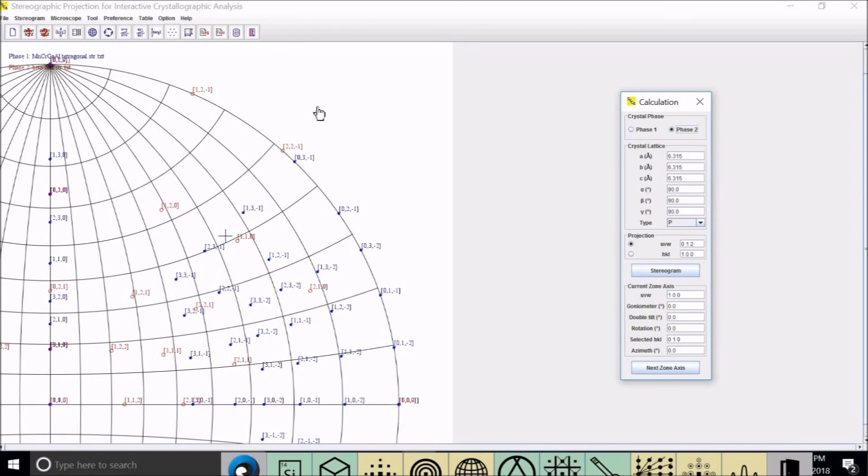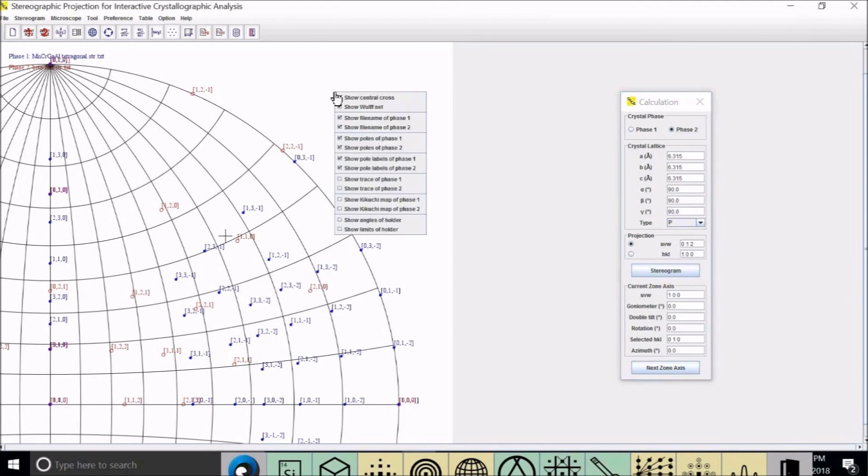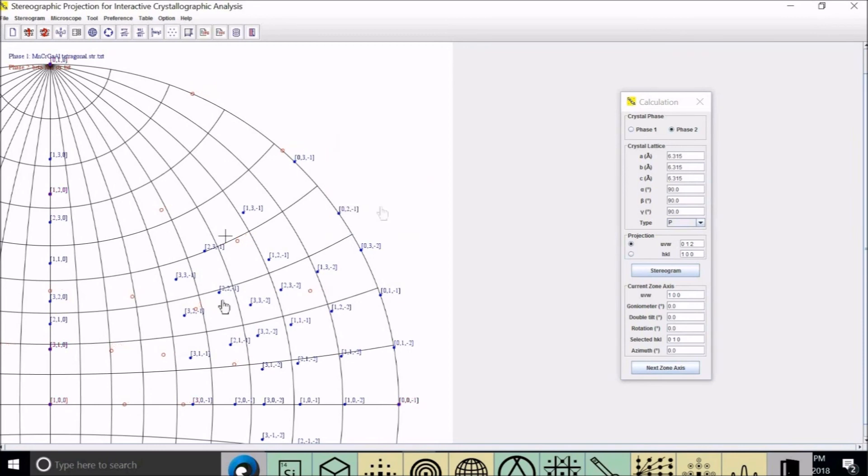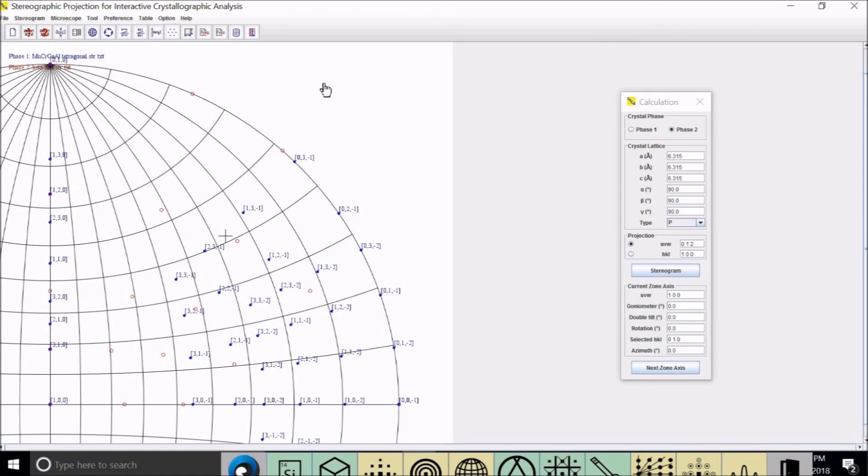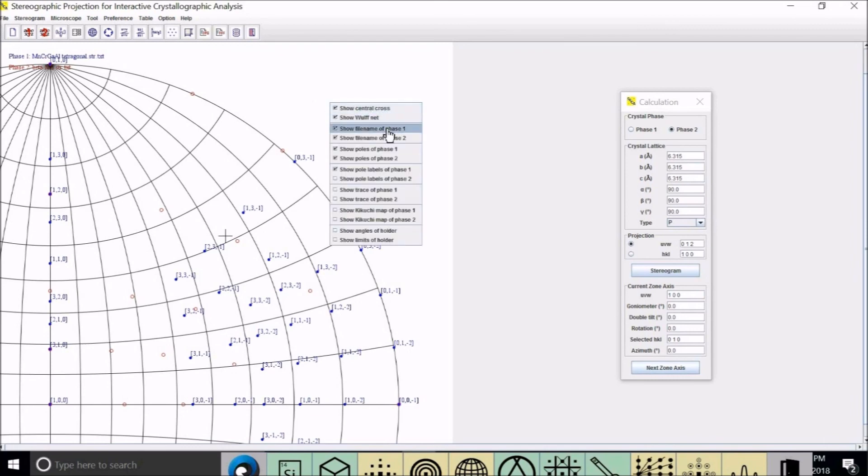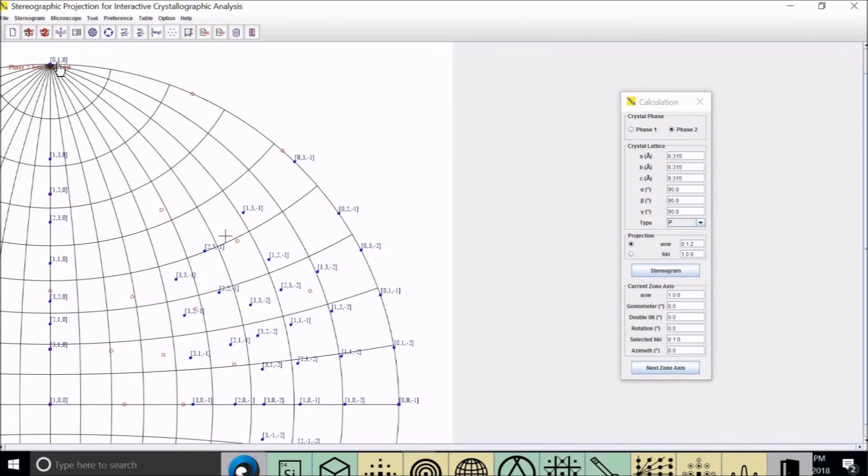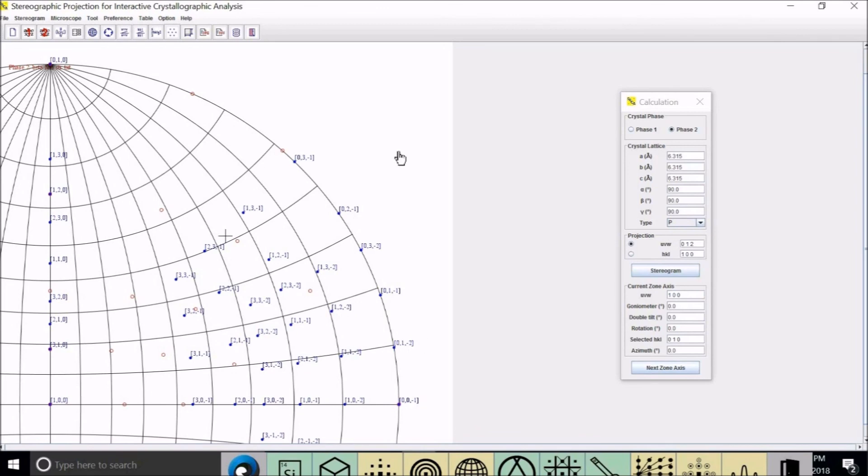To show the labels, I can first show only the label from the first phase. So this is 1, 0, 0, 3, 1, 0, and 1, 2, 0. Here I can turn off the phase one labels. So you can see phase two indices: 0, 1, 0, and 0, 0, minus 1, or 0, 0, 1 in the opposite direction.